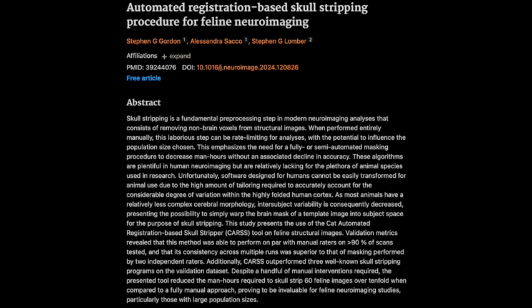Atlas Brex, for example, showed some promise. It delivered good results on about half of the images. So a 50-50 chance of success. Not too bad, but I imagine consistency was an issue. Exactly. It was a bit of a mixed bag with Atlas Brex. Some of the masks were great, while others had noticeable errors and misalignments. So not quite ready for prime time, at least not without some further refinements.